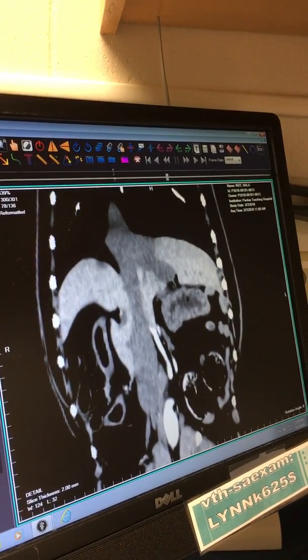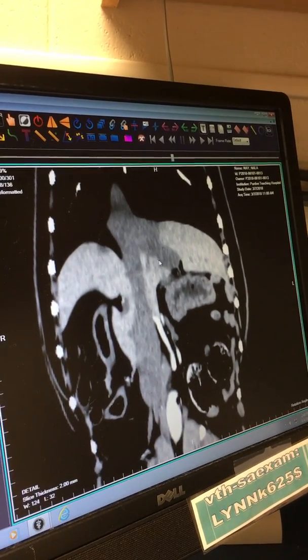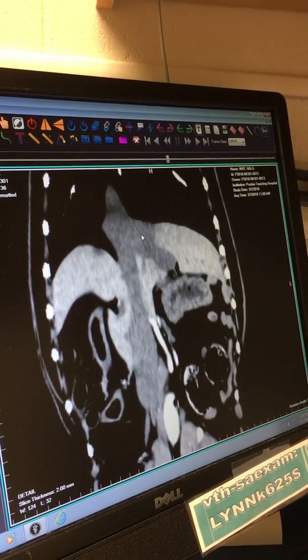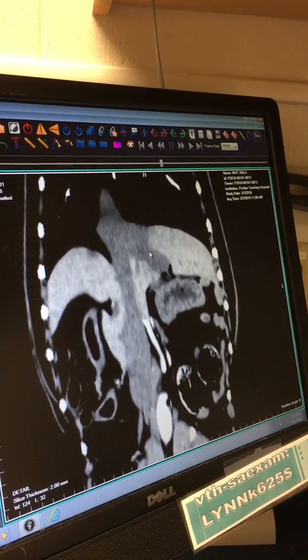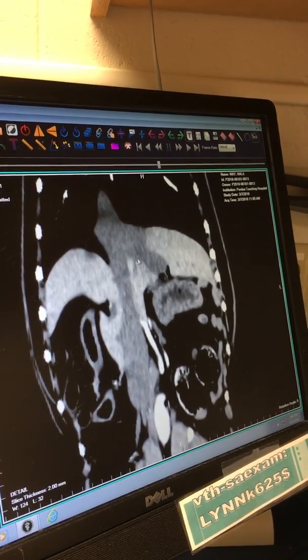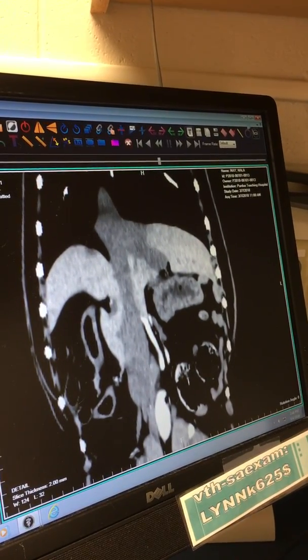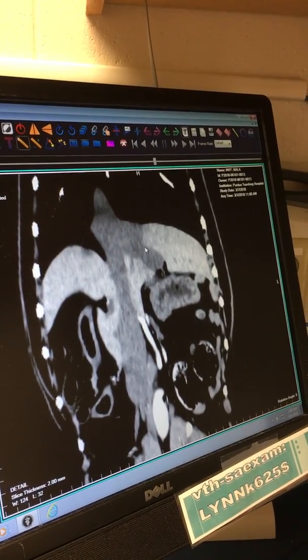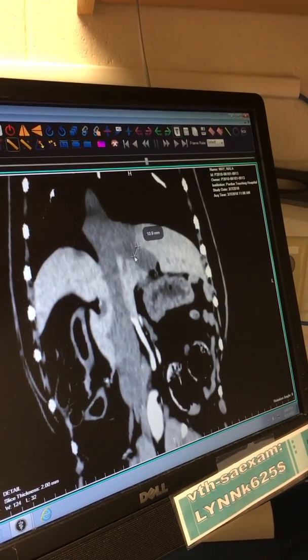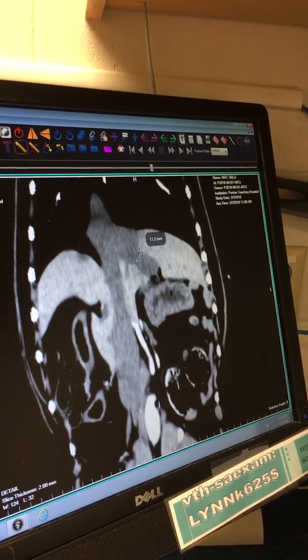So the idea is we'll come down from her jugular vein, past her heart, and then gain access to the shunt vessel here. So we'll have a catheter that comes into here, and then we'll deploy the plug right here. It looks like there's a narrowing to the vessel right here a little bit, and we've measured this a number of times. How big is the plug that we got? I believe we've ordered the 22 millimeter plug, so it's the biggest plug.